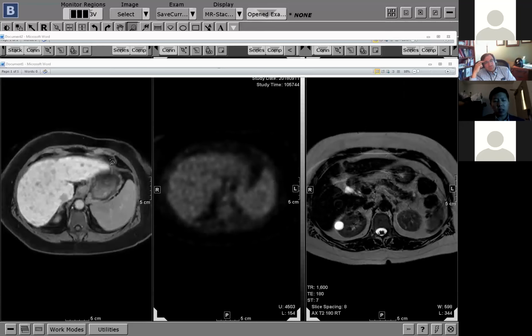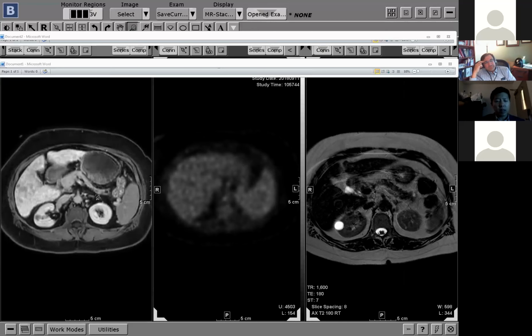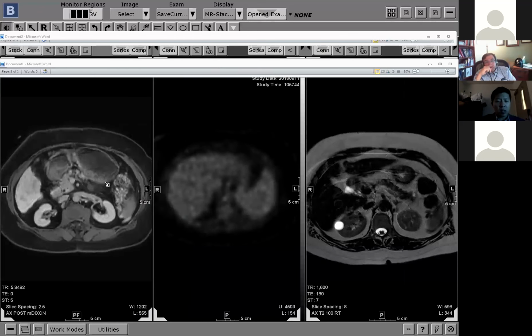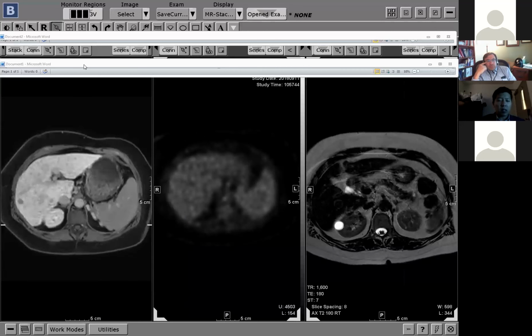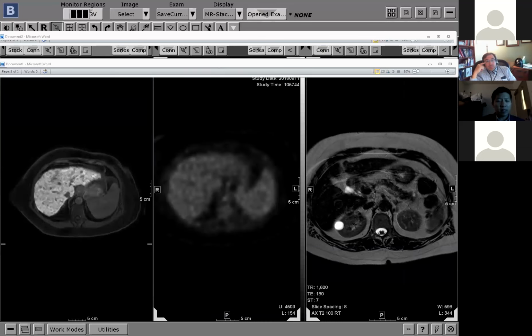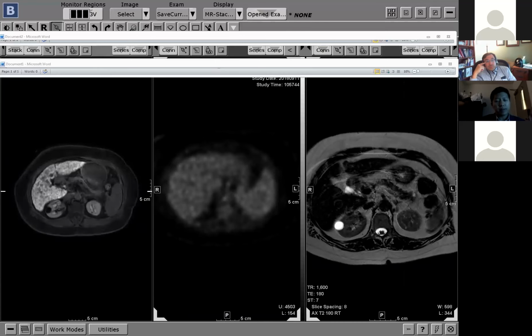These were all just cirrhotic nodules, and you can see here, on delays, you can't see anything. But it was real. It was already there. An interesting case. But again, do you think this is callable? I don't know. I think it's very hard. These were all just cirrhotic nodules. The liver was full of them.